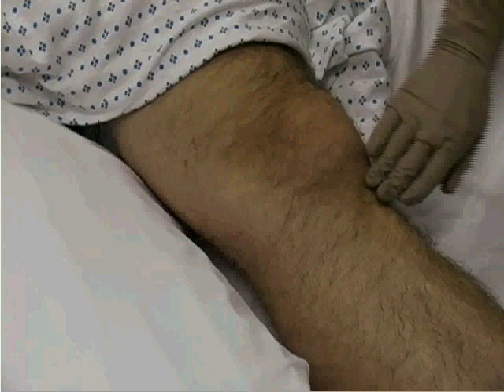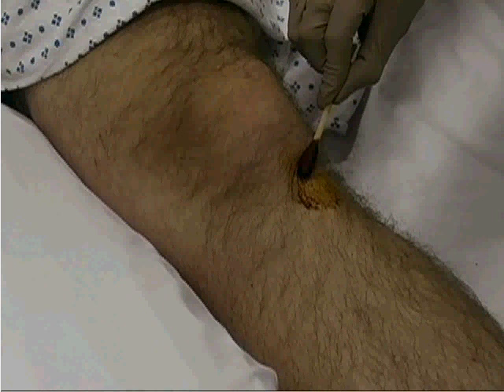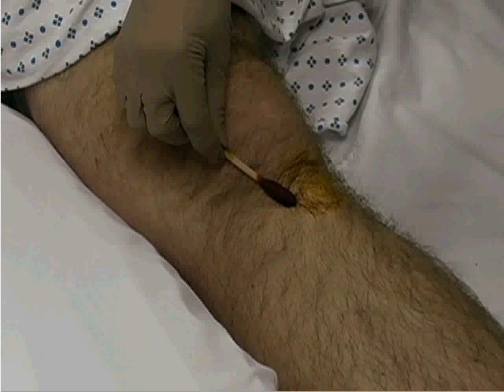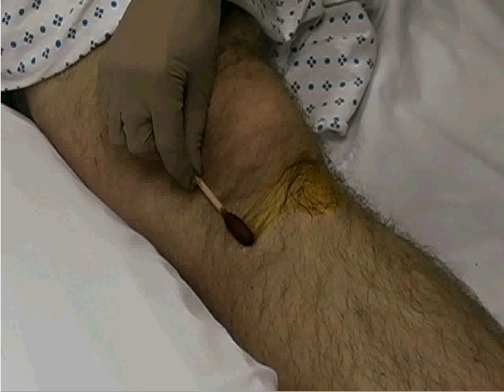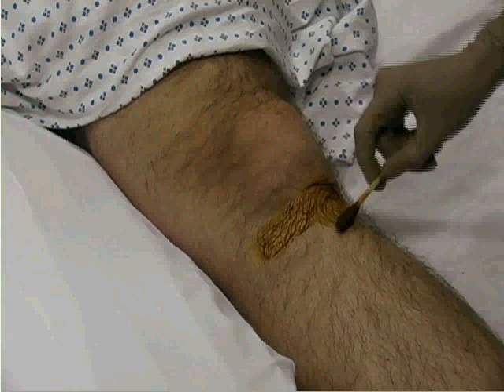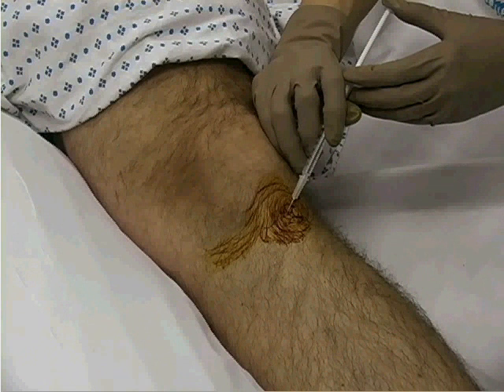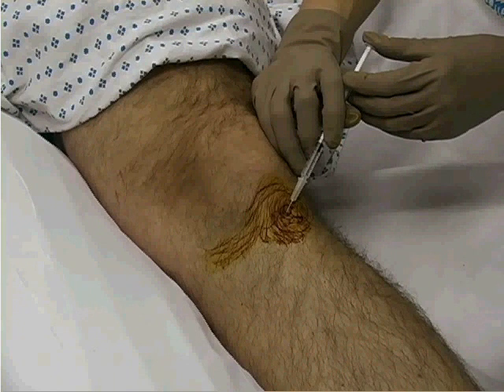Prep the area where the needle is to be inserted. Start at the tibial tuberosity and proceed linearly toward the tibial condyle. Repeat the prep three times, allowing the prep solution to dry before needle insertion. Using a tuberculin syringe and attached 25-gauge needle, create a wheal with 1% lidocaine in the cutaneous tissue over the tibial tuberosity.